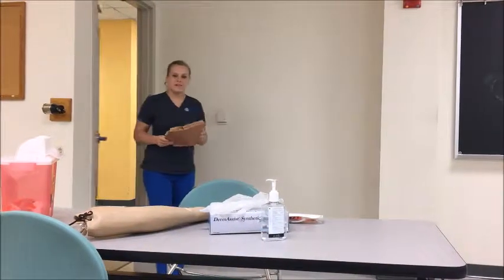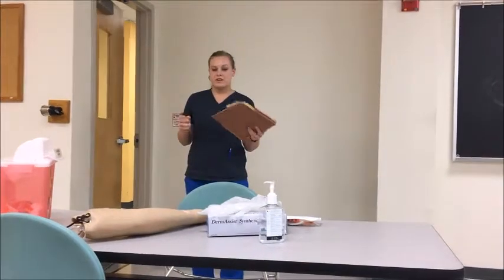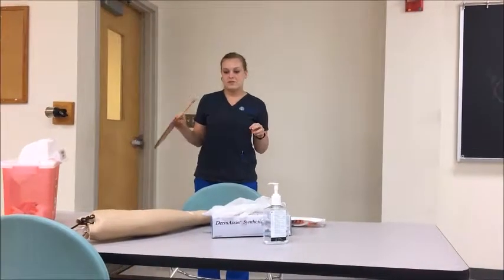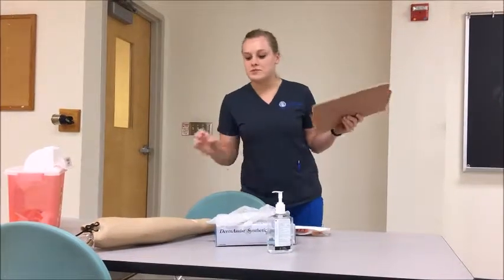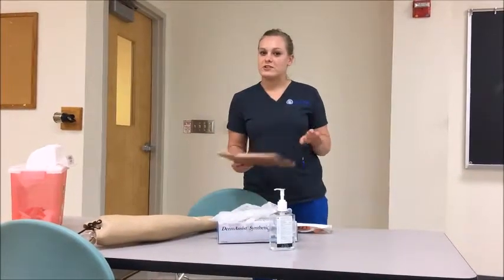Come in! Hi, I'm Xenia from the respiratory department. I'm here to take an ABG. Could you please confirm your name and your date of birth? I'm just making sure I check their armband to make sure that's all correct.